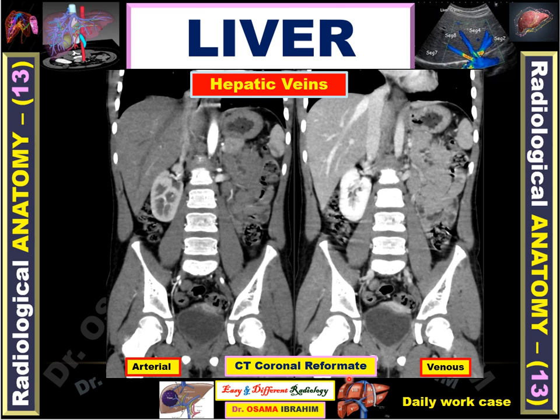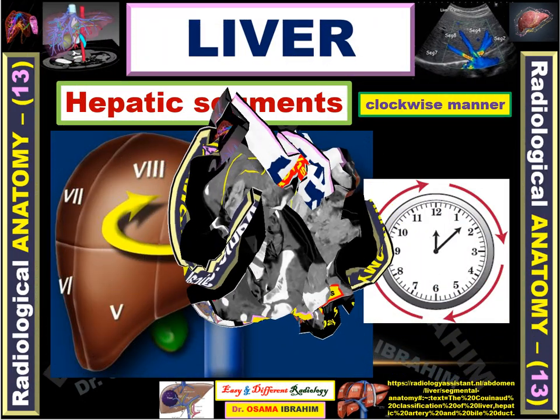This coronal reformatted CT examination shows both arterial and venous phases. In the venous phase, the IVC is opacified, whereas in the arterial phase only the aorta is opacified. The vessel passing through the liver parenchyma cannot be seen clearly in the arterial phase, but in the venous phase it is opacified and drains through the inferior vena cava — so this represents one of the hepatic veins.